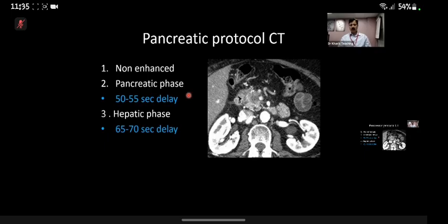So hint, something like esophagus. And then endoscopic ultrasound. Yeah, endoscopic ultrasound. So in esophagus, you remember, and this is a viva question, when you do TNM staging, for T staging, endoscopic ultrasound is routinely done. In pancreas, it's slightly different.